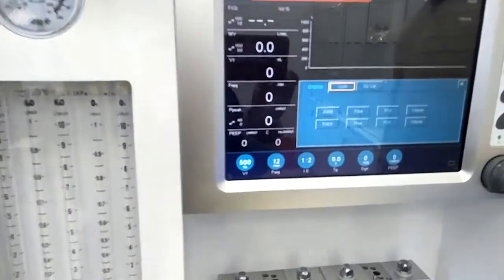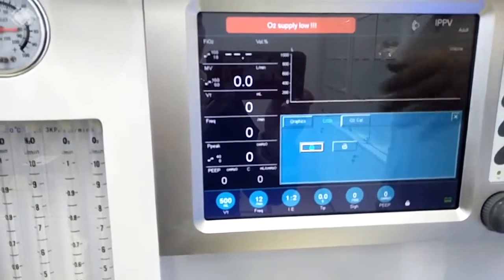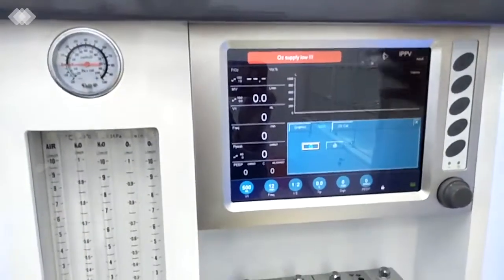And the second one here will be the lock. Once we press it to lock, all the ventilation modes and parameters cannot be changed again. It just ensures that if the patient is alone in the patient room, he will never do some wrong operation.